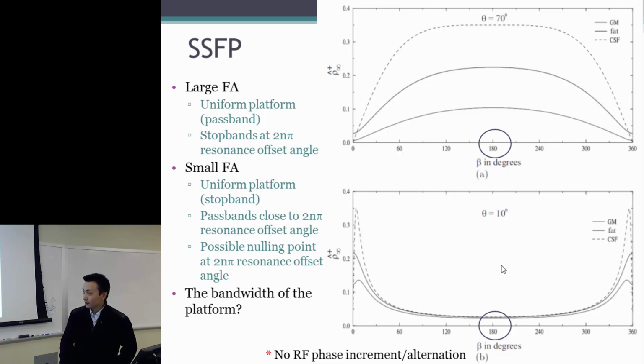People have tried to use this band to achieve functional imaging, because what functional imaging does is the blood flow change induces a local T2 star change. This T2 star change is related to the local field inhomogeneity change. So if we put this band right next to the cortex, the very small field change induced by T2 star would give you a very high signal change. People have already tried this.